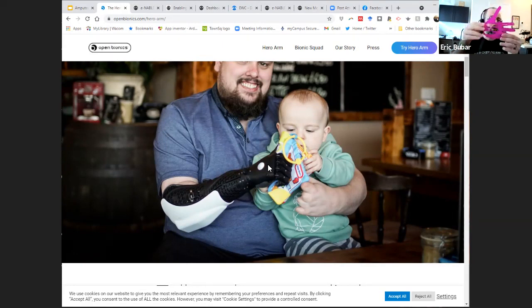And we're trying to make it small, right? I know that's a big issue that I've seen in the literature, at least. People in the room can correct me, as you probably have more experience than I do, but prosthetic devices tend to be large. It seems like every single one has a man-sized hand, and nothing's a little bit smaller for, like, my hand, or a female's hand or child's hand. So we need smaller bionic designs. That's what we're targeting here.